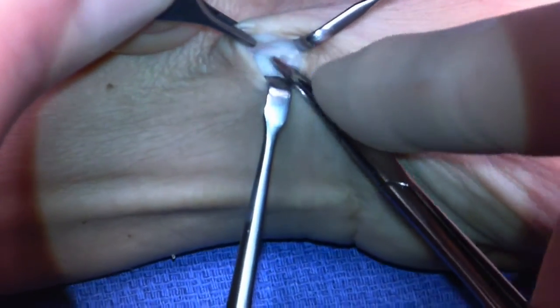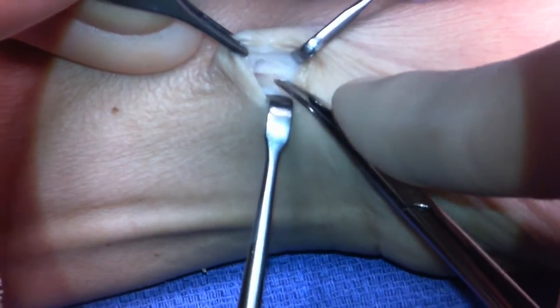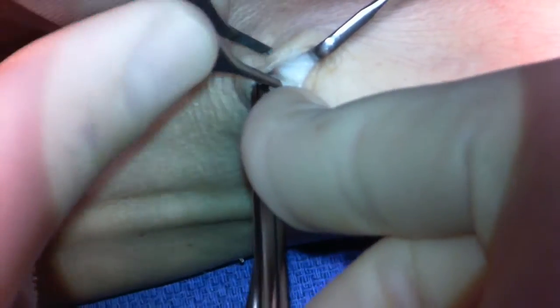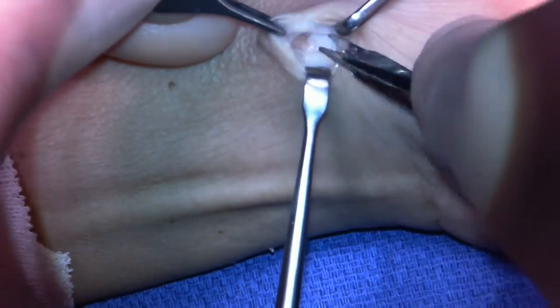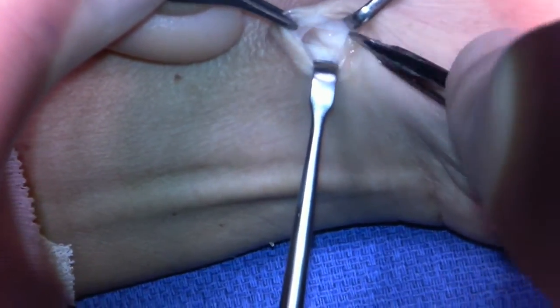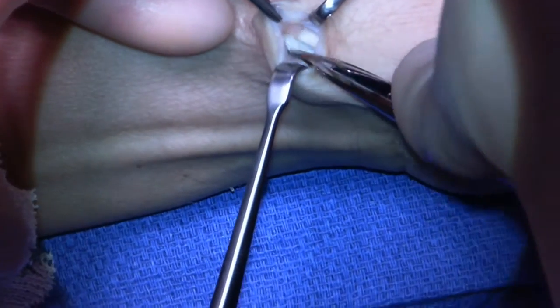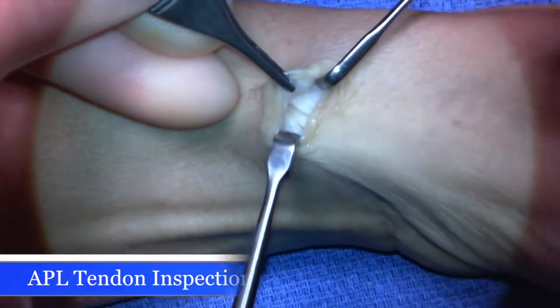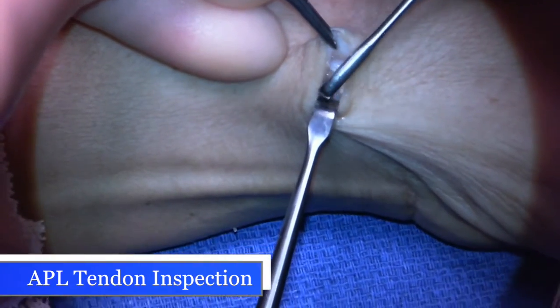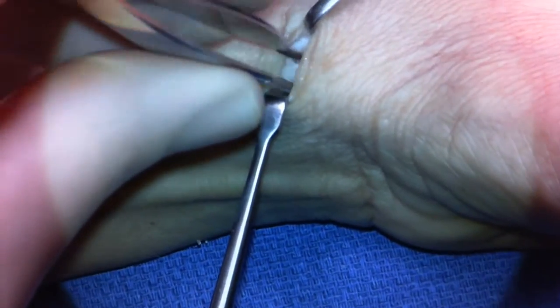It's a very tight compartment. You can see some inflamed extensor tenosynovium coming from the tendon sheath. You can see a rush of yellowish inflammatory fluid. You can see the APL tendons, which there are several slips of.